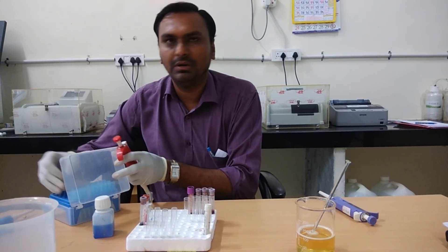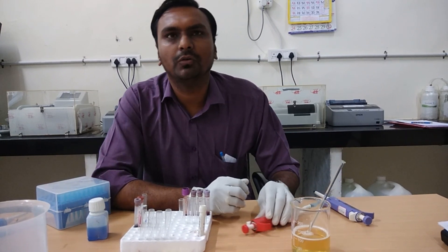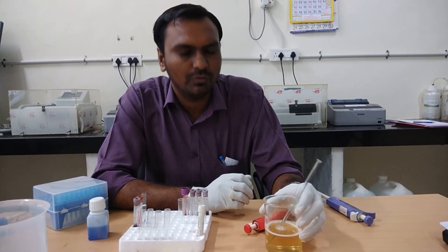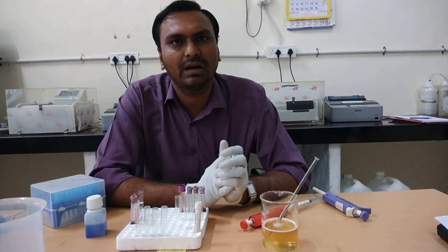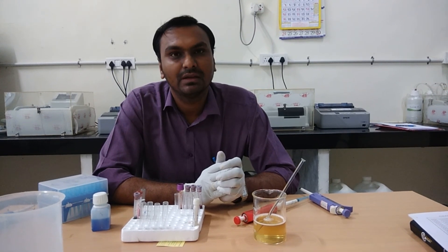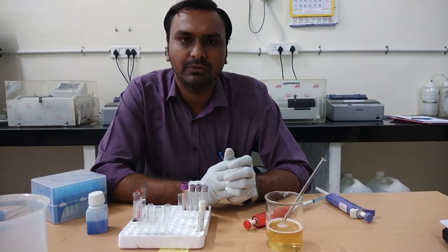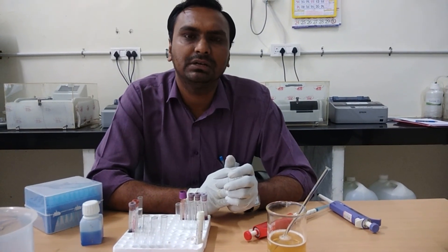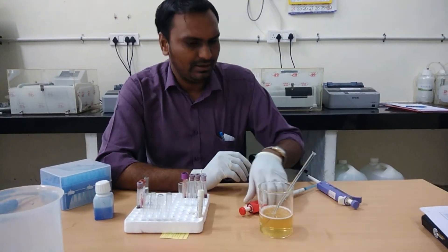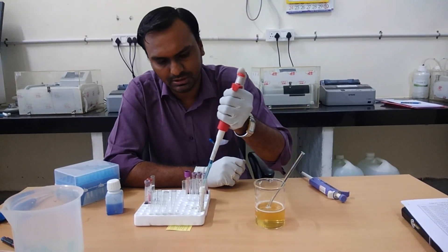For the procedure of the solubility test, we have to take 1 ml of solubility reagent. I have personally prepared this solubility reagent which consists of 25 grams of K2HPO4 (di-potassium hydrogen phosphate), 14.3 grams of KH2PO4 (potassium di-hydrogen phosphate), 250 mg of saponin powder, and 100 ml of distilled water. I will take 1 ml of this solubility reagent in each of the test tubes.